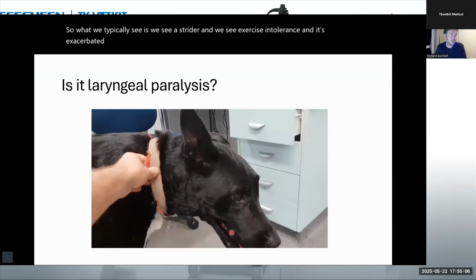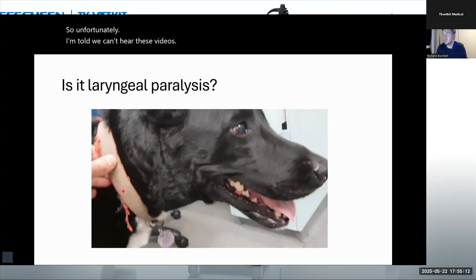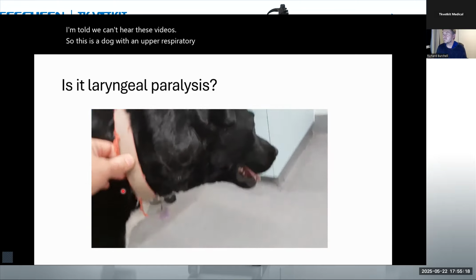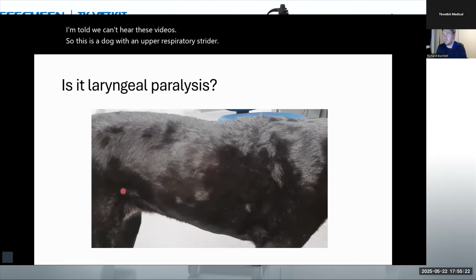So unfortunately, I'm told we can't hear these videos. So this is a dog with an upper respiratory stridor. We can see there's dyspnea.